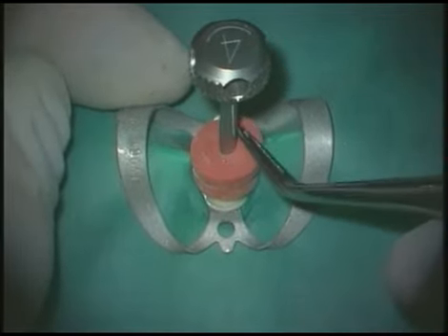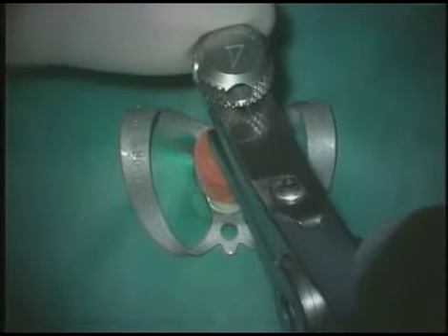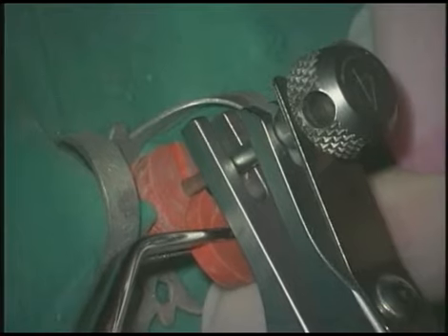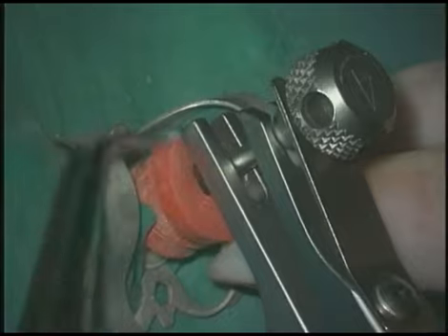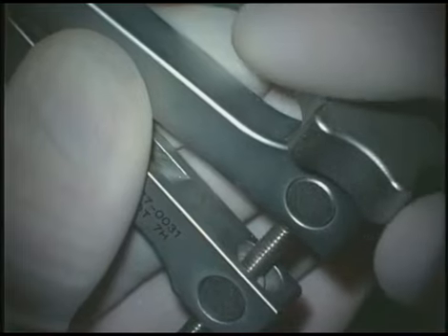Notice with the proximity of the adjacent teeth and their incisal edges, we're using a second, and sometimes we'll find out as we begin to insert the extracting plier that we might even need to place a third one. This will kick the lower jaw further away from the adjacent teeth so that we can introduce the extracting plier safely. Slowly and progressively turn the screw knob.